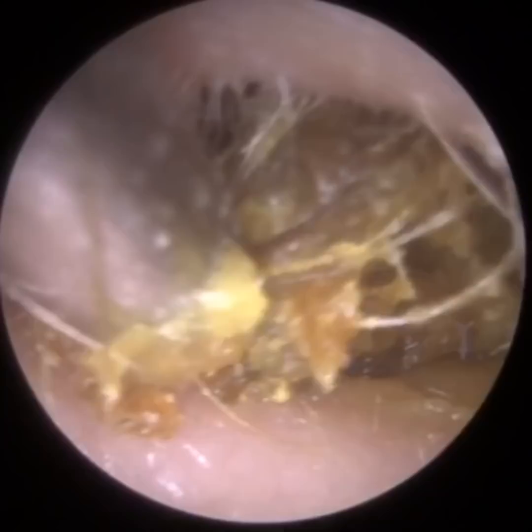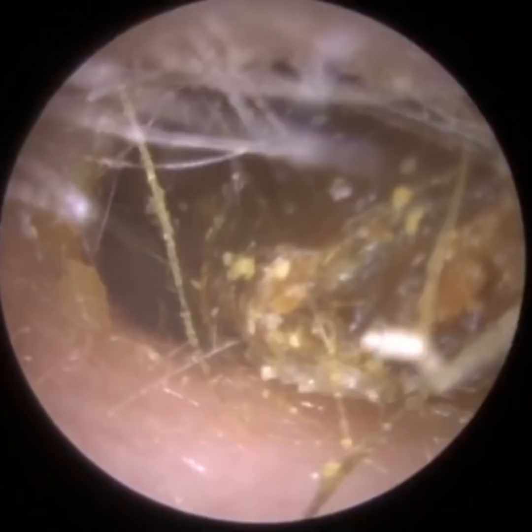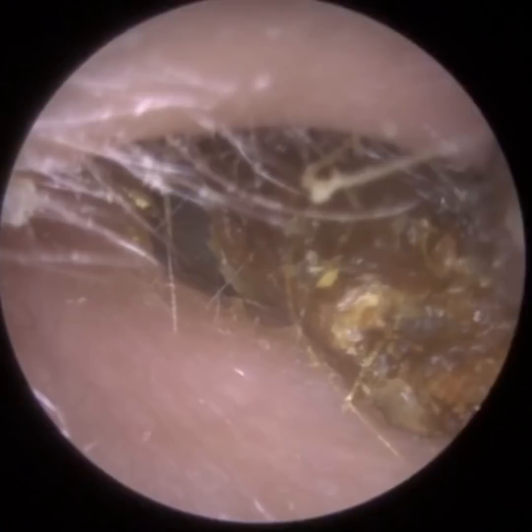Once we remove it, you'll see the patient has been using a lot of drops, and the drops have seeped through this plug of wax and collected in the ear. So behind this wax plug is almost a puddle — I think they were using olive oil — and that had also caused the skin at the base of the ear canal to become very wet and it needed to be removed. There was also some drops that settled on the eardrum itself.